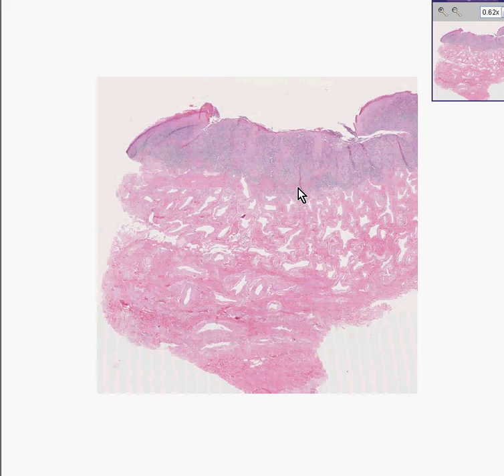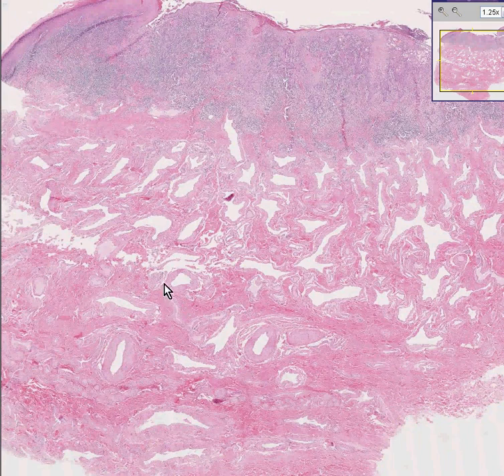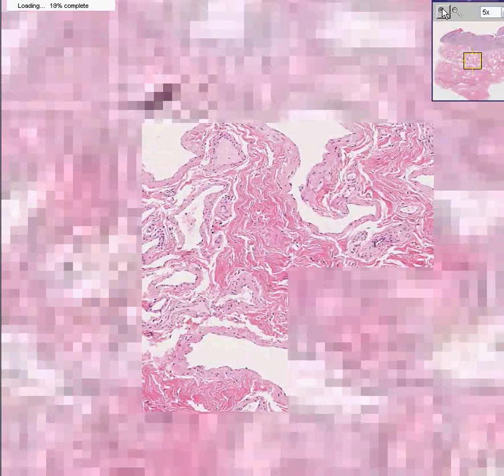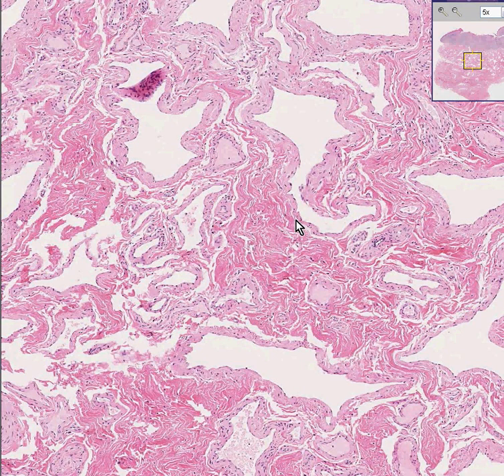Funny thing is there appears to be a lot of inflammation and ulceration of this skin. In addition, the deeper tissues do not look like normal dermis and they do not look like normal fat. They look like a lot of irregular stellate vascular spaces lined or surrounded by smooth muscle type of tissue.